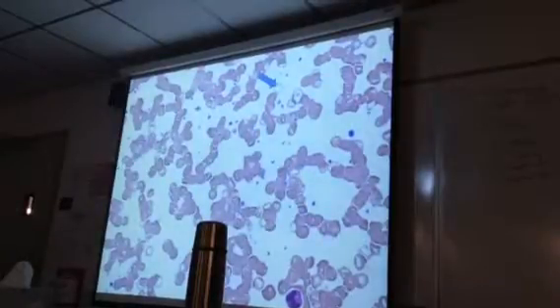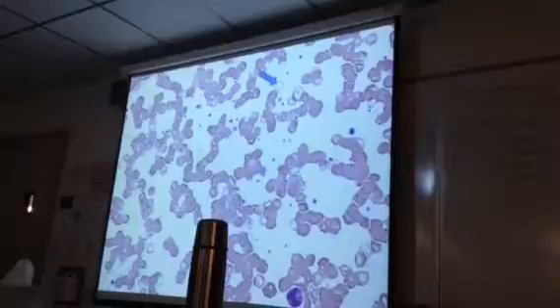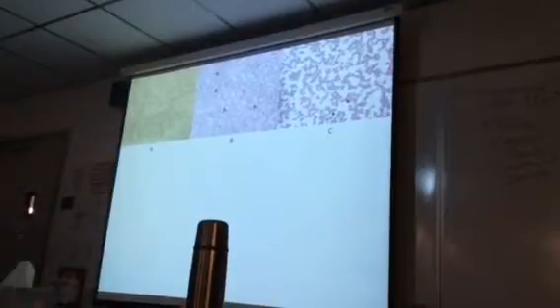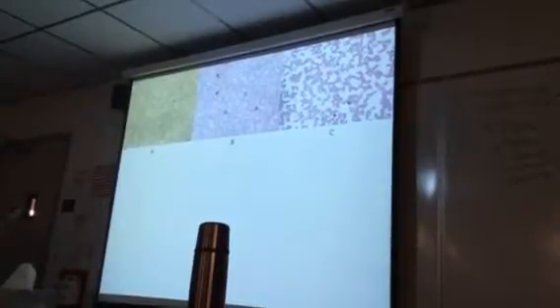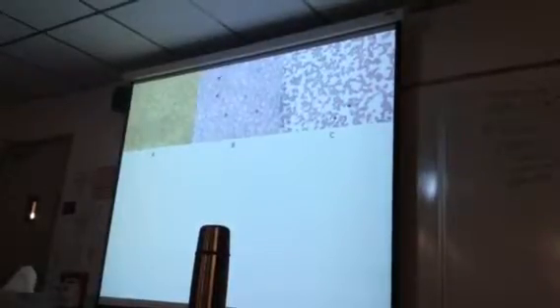Okay, this is a blood condition. I'm pointing to a microcyte. This is iron deficient anemia. Recognize it as that. Here's 3 things. I know it's kind of hard to see in the back maybe. A, sickle cell anemia. B, eosinophilia. This is also our iron deficient anemia. Okay, so those are different blood conditions. 2 of them are anemias.